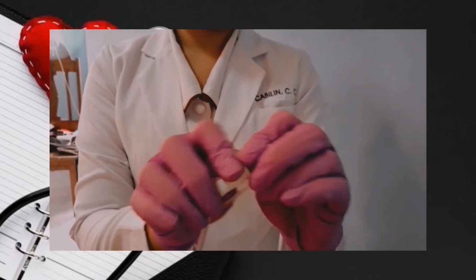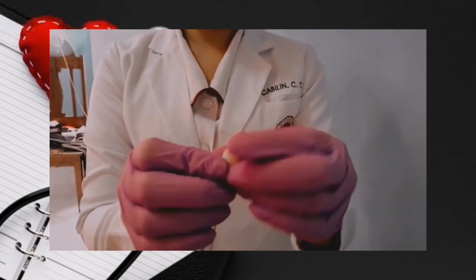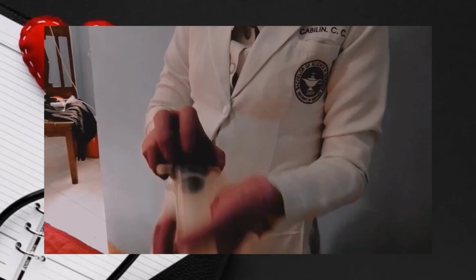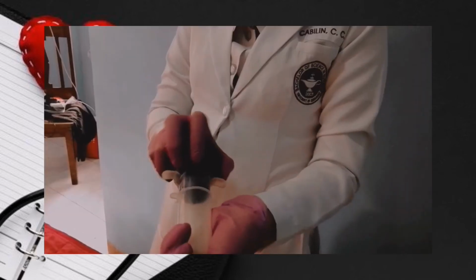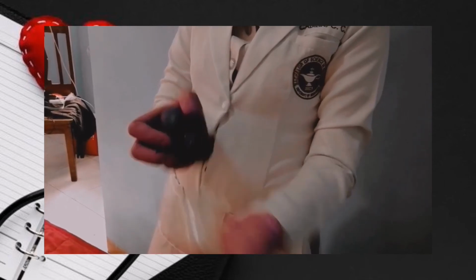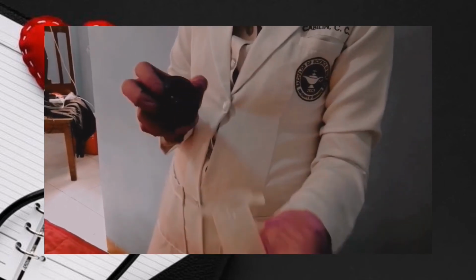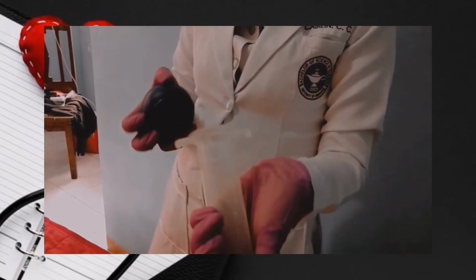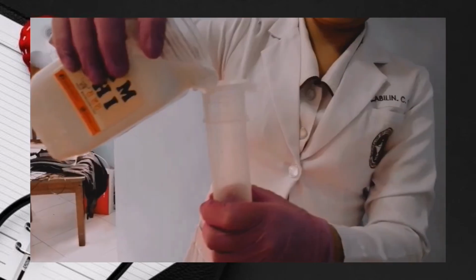The next procedure is to clamp the nasogastric tube. This is to prevent air from entering tube. The next procedure is to remove the bulb or plunger from the syringe. Reattach the syringe to the nasogastric tube. This is to provide a system to deliver feeding.